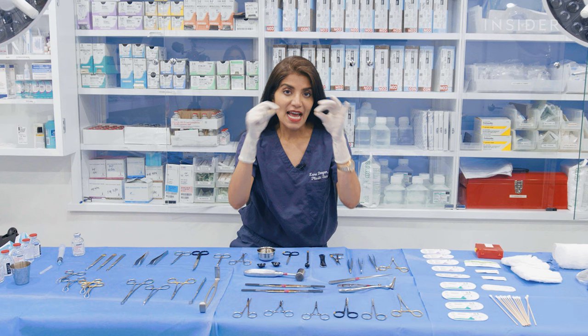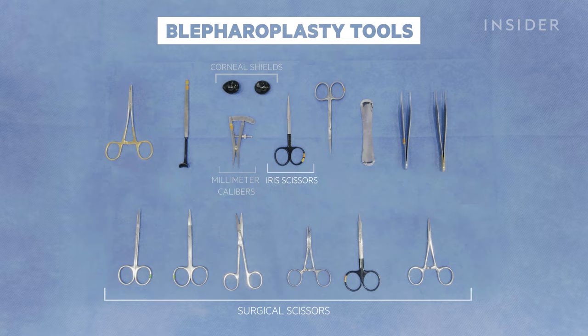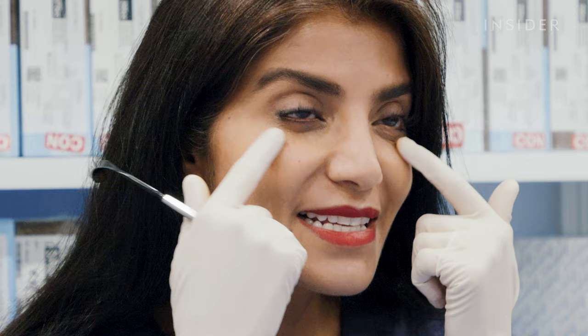After planning and making my incision line, I use an assortment of fine surgical scissors, like iris scissors, in order to dissect out excess skin and puffiness from the upper lids and from the lower lids. When I'm using the lower lid incision approach, I use instruments like this specialized Desmarres retractor to get placed inside the lower lid to retract out the tissues in here to better visualize puffiness and excess fat under the eyes.